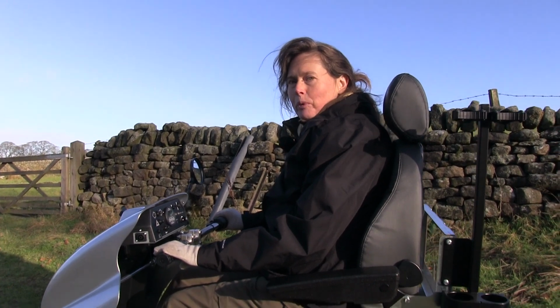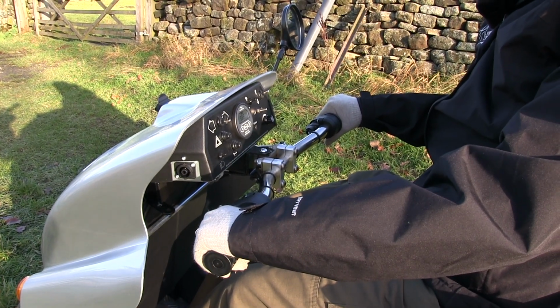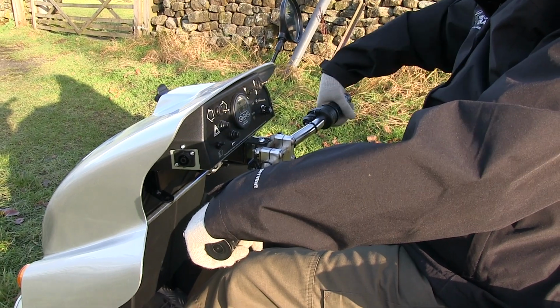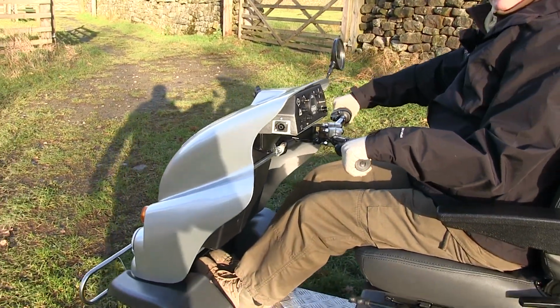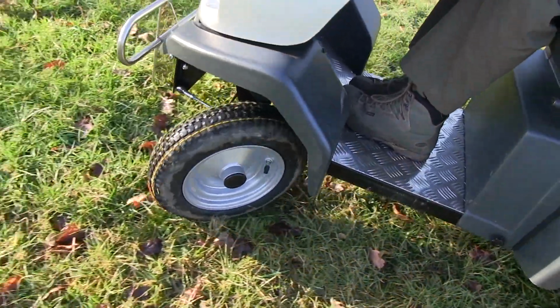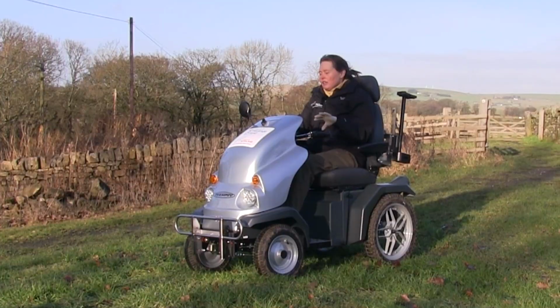So to steer the Tramper, we've got the handlebars. It's quite simple that you push and you pull with one hand and the other. So to move left, as we twist the grip to move, we pull the left handle towards us and push the right handle away like you would on a bicycle. And to move to the right, you pull the right hand grip towards you and the left hand grip away.